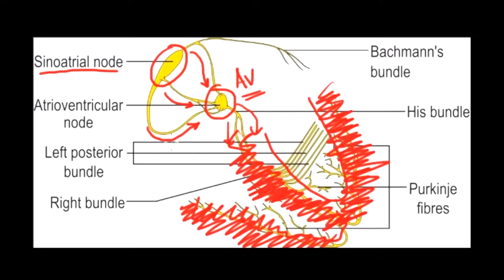Even though there is electrical conduction going down this, what we're seeing electrically on an EKG is the depolarization of the actual muscle cells. Okay? So just be aware of that. Okay, so to get a little bit more of an insight about what's going on, let's go down to the microscopic level. And I want to show you a myocyte here.